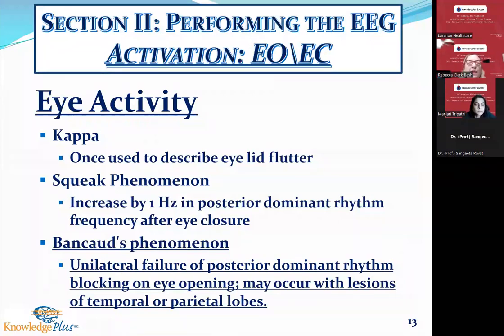Squeak phenomena, when the patient has their eyes open, their PDR, their posterior dominant rhythm, decreases by about 1 to 2 hertz. When they close their eyes, which is called squeak, it increases then by that 1 hertz. Bancaud's phenomenon is when you have unilateral failure of PDR on eye opening, and that may occur with lesions of temporal or parietal lobes. However, again, when it is the only finding, it is not considered significant.